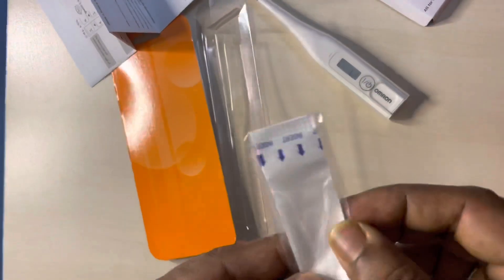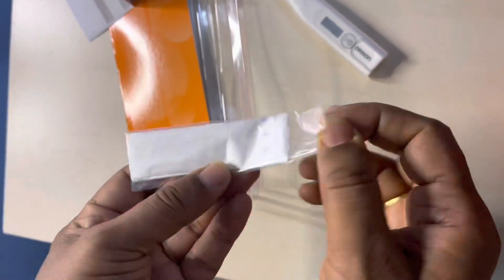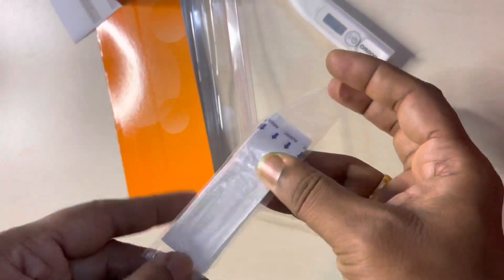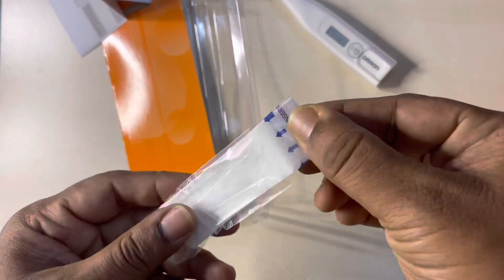This package includes the main unit, test battery, protective case, instruction sheet, and five probe covers. It is also water-resistant.